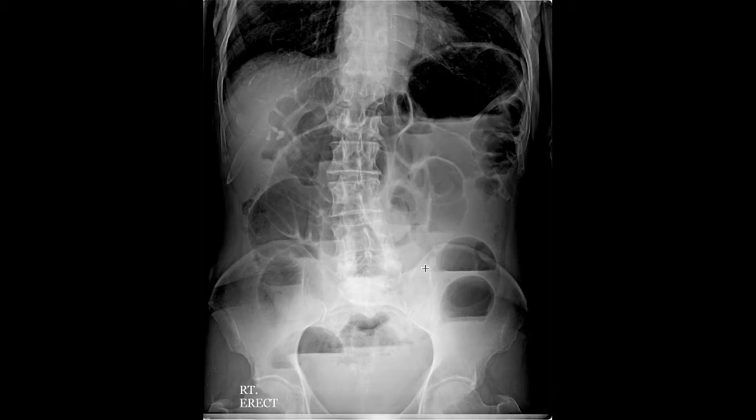The evaluation criteria of the image: it needs to include at least the lower one third of the chest. Right here, you need to detect subdiaphragmatic air, or query pneumoperitoneum, so the technologist that acquires the image must include the diaphragm area. If it was not included, then the physician has the right to send the patient back to the department to get it, because you cannot diagnose subdiaphragmatic air if you do not have the diaphragm. You cannot rule out pneumoperitoneum if you do not have the diaphragm.